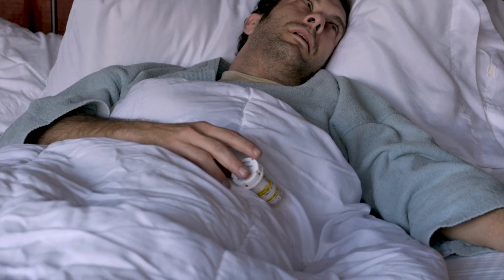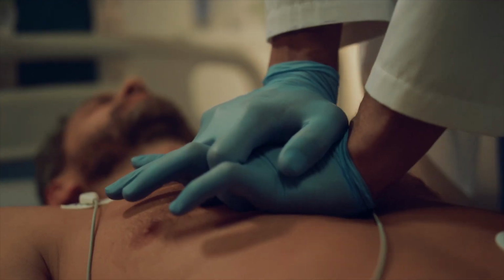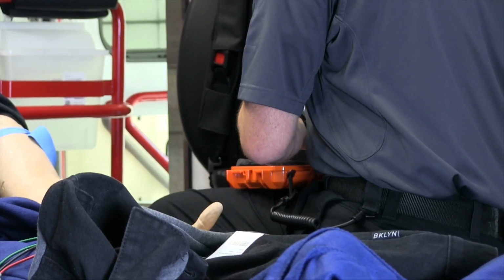Now, although you do have the option of placing an SGA without any medications for those patients who are profoundly obtunded, these are rare, very rare, and in most patients who are not in cardiac arrest, they're going to need some medication. If ketamine alone is sufficient, just go with ketamine. But if you feel ketamine alone is not sufficient, feel free to also give rocuronium. In this case, you are essentially performing RSI, but with a supraglottic instead of an endotracheal tube.